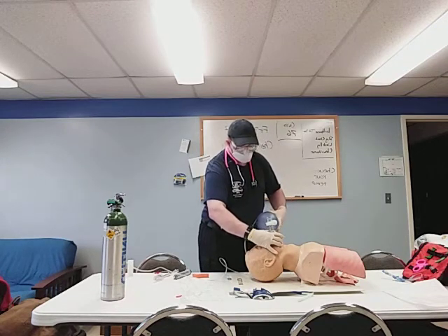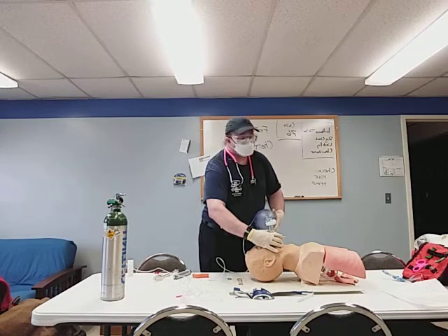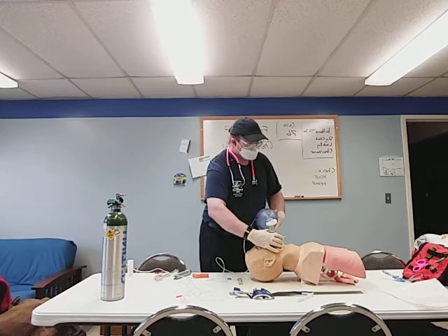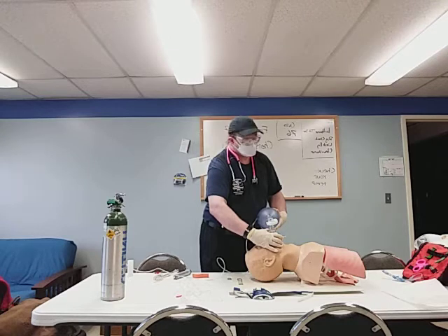Now I've got good chest rise, and now we're getting some better pulse ox readings, hopefully. All right, so I will ventilate for about 30 seconds, and my examiner will auscultate the chest and tell me there are bilateral equal breath sounds, and medical control has ordered a supraglottic airway. So that is what I'll do now.